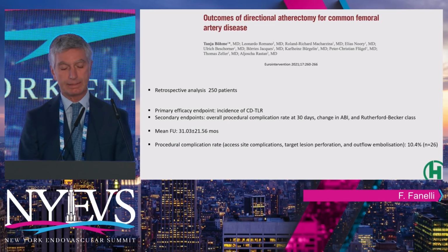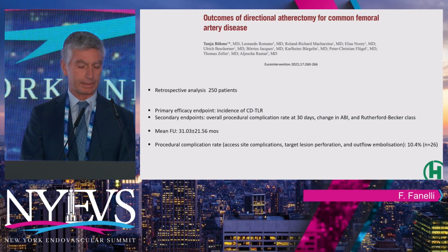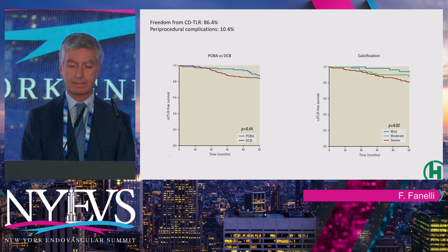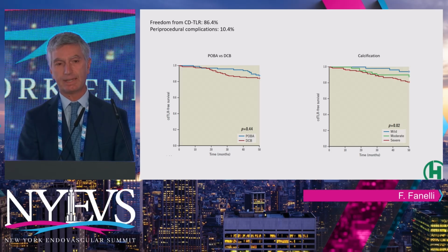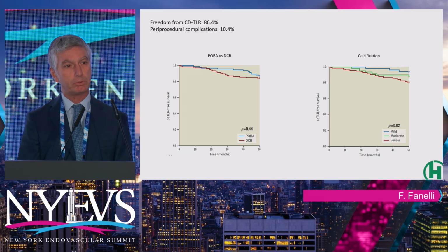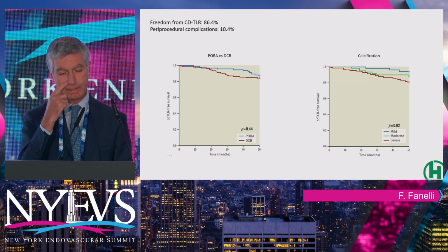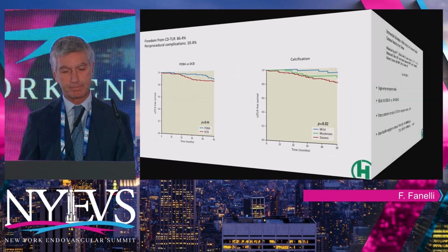This is a study that reports some data regarding the use of directional atherectomy. It's a retrospective evaluation of 250 patients with a mean follow-up of 31 months. And what is interesting, you can see on the right side of the screen, is the calcification. You see the outcome is completely different according to the severity of calcium. So when there is a lot of calcium, again, we must be very aggressive to maybe debulk the lesion or shock the lesion and then complete the treatment modality. However, they report a freedom from clinically driven TLR of more than 80%, with a complication rate of around 10%.